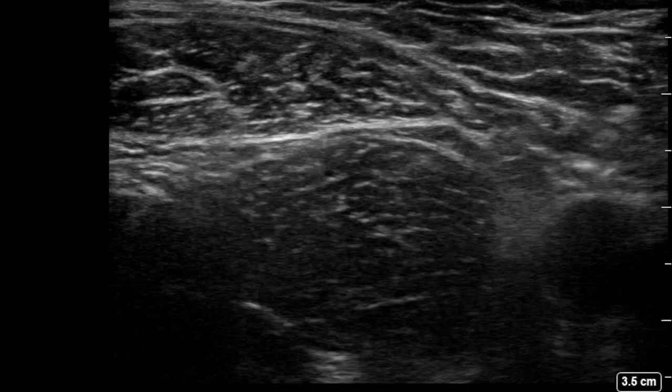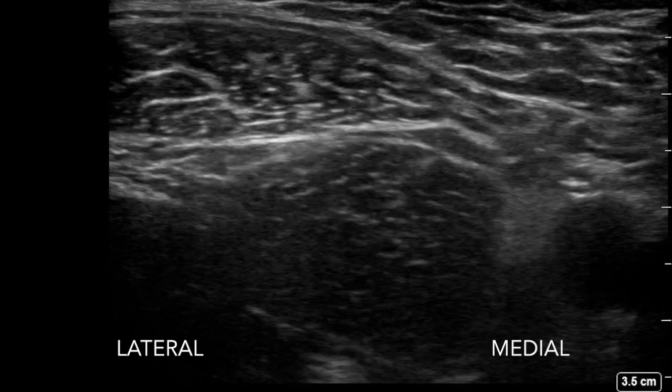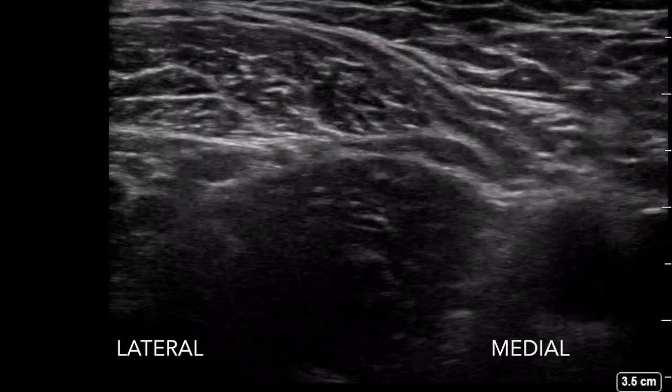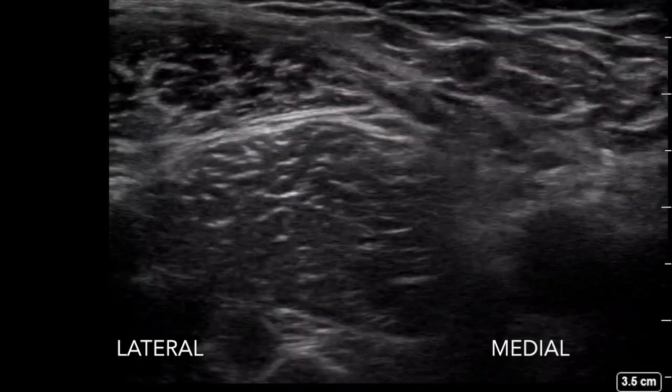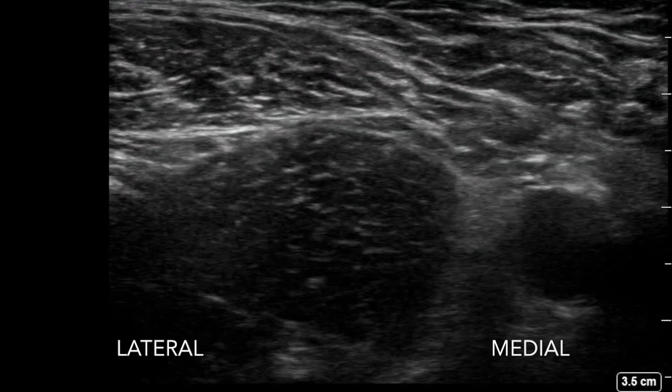The fascia iliaca compartment block is commonly used in patients presenting with fractured neck of femur and aims to block the femoral nerve, the lateral cutaneous nerve of the thigh, and the obturator nerves. It may be performed using a supra or infrainguinal approach.